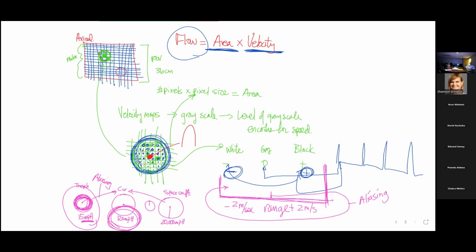So when you're thinking about measuring blood flow, you have to anticipate with MRI what your velocity range is going to be. And if you don't do that correctly, you don't have the right dynamic range. You've got this beautiful technology, but you're not going to set up the ability of the scanner to appreciate the information that you seek. So where does that come up? We're going to talk about that in a minute.